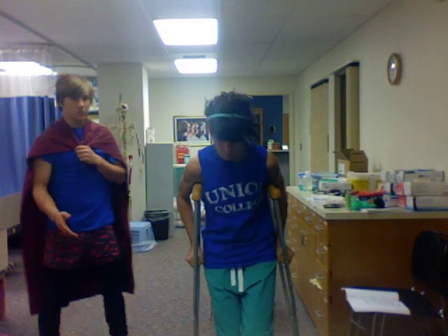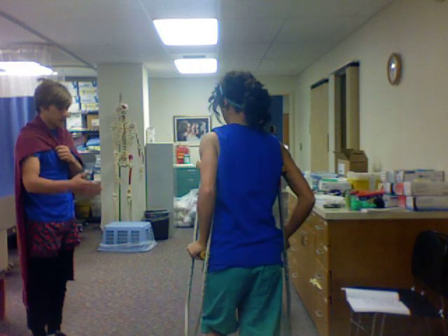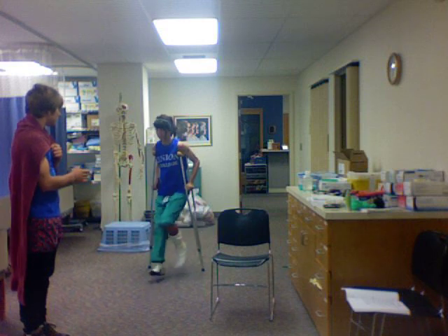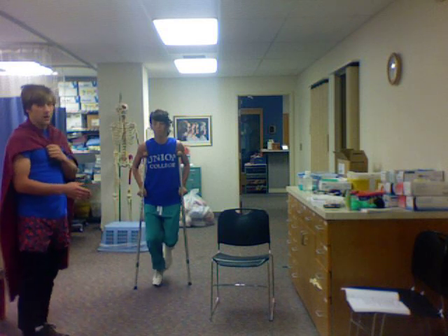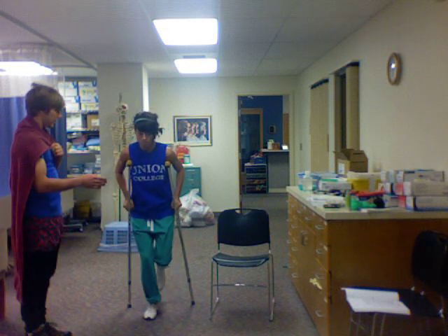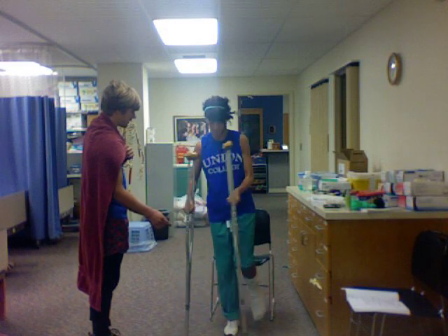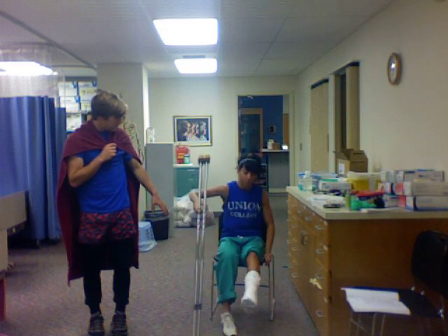And now you are walking — wonderful, good job. If you could turn around and come back this way. Just get comfortable with ambulating with your crutches; it can be kind of awkward at times. Remember, you don't want to hurry yourself with this, because if you hurry yourself you can fall down. Now that you've ambulated, I want to teach you how to sit back down. Come in front of the chair, take both crutches in one hand, reach back for the chair, find it, and sit down. Wonderful.